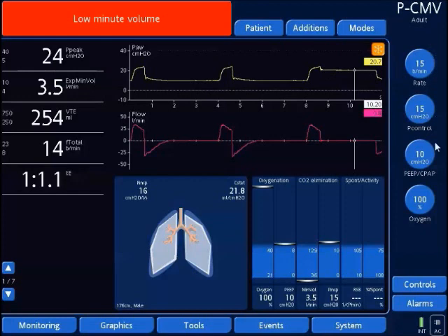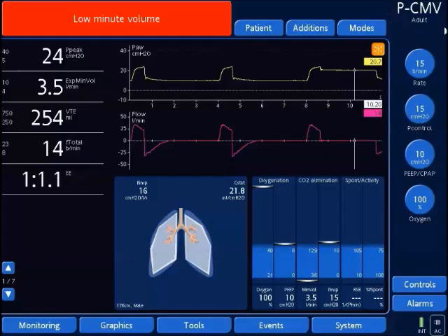Over here are ventilator controls, and whatever control is not easily accessed is going to be under this control tab right here — I'm going to use this for the demonstration to open up the controls. One other thing is the mode of ventilation; this tells me what mode I'm currently in and for what patient category. So this mode is pressure control mode.